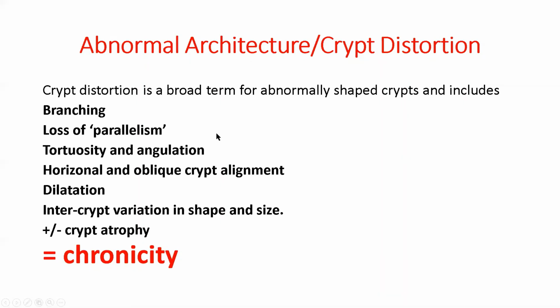So when you put all of those together, when you assess all of what we talked about, then you will tell me the first sentence of your report. That is the first sentence: large bowel mucosa with abnormal crypt architecture. This is what it is, or with crypt distortion. So all what I have explained in the last seminar and this seminar is how you will put that sentence.